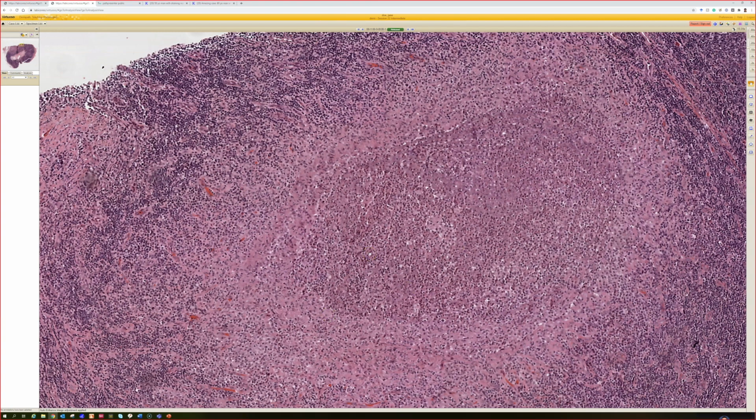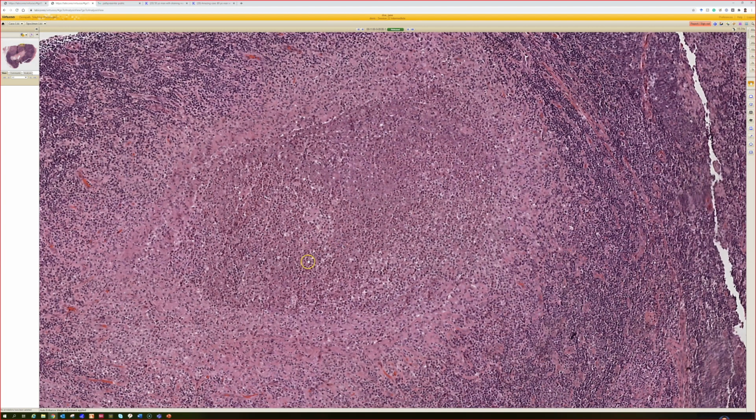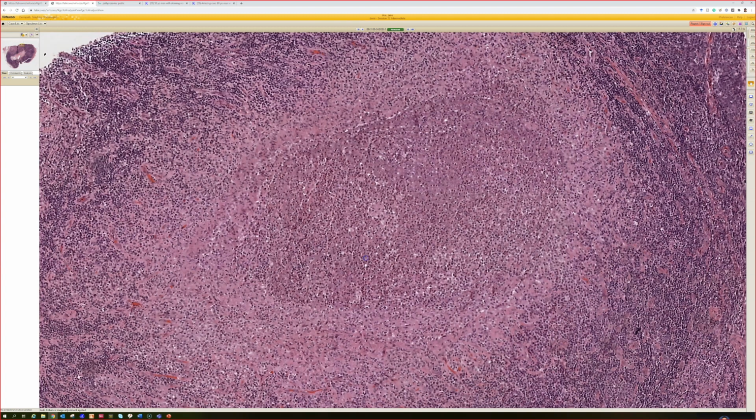These granulomas packed full of tons of neutrophils in lymph nodes are going to be a strong indicator for cat scratch. And you can supposedly see the organisms on, I think, Warthin-Starry or Steiner, a silver stain. Again, I find those really difficult to interpret. You can do molecular to prove it, and Bartonella henselae is the usual causative organism, although I think maybe rarely Bartonella quintana can cause it. I feel like I've read that before, but Bartonella henselae is the most common cause.